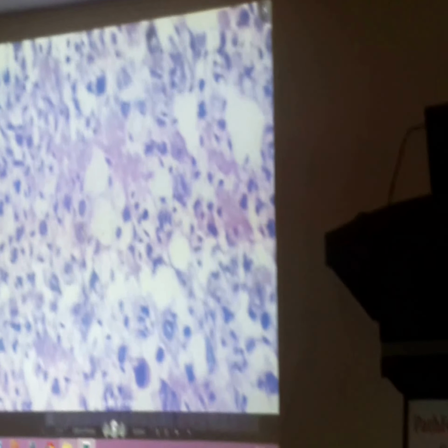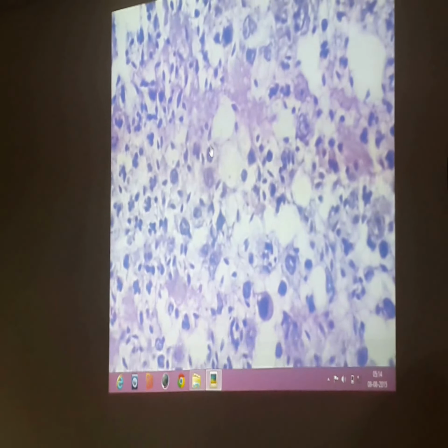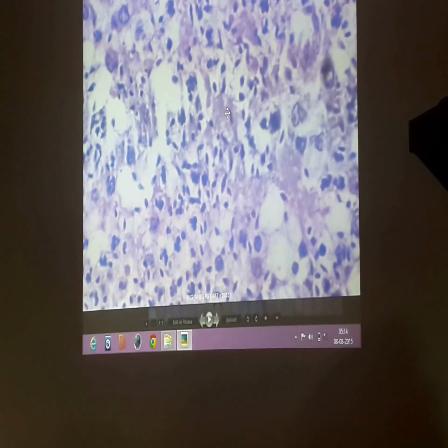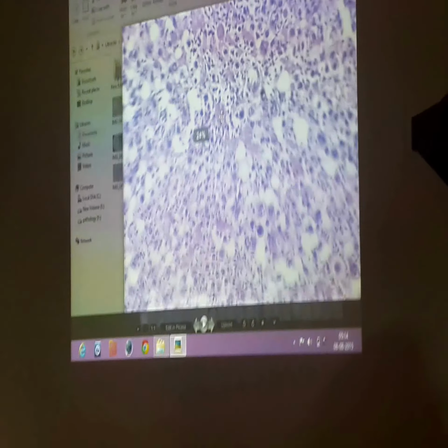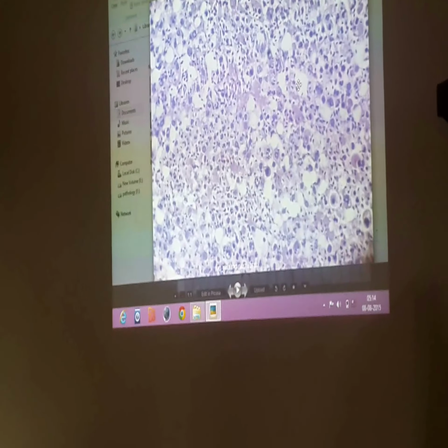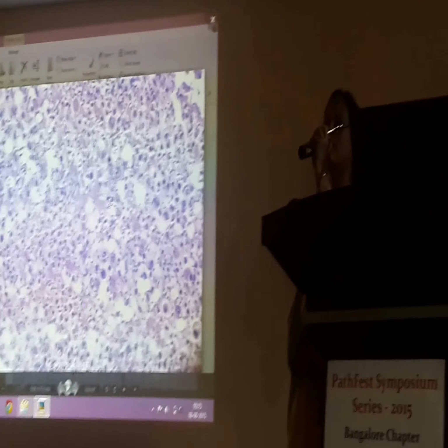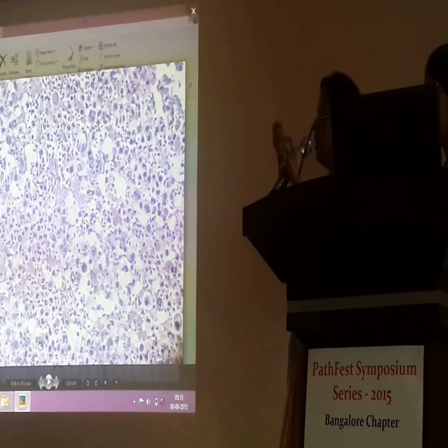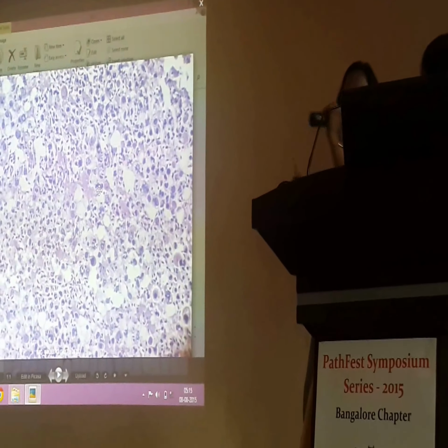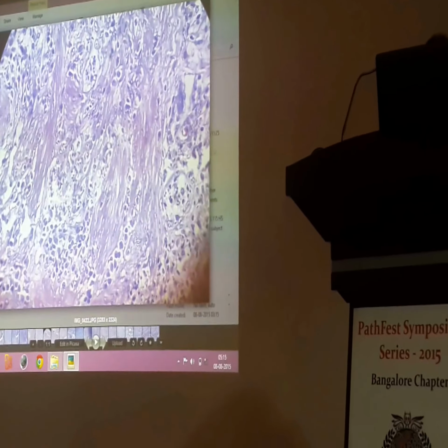It's like? Sperm, yeah. Yes, I just gave you this only to observe the sperm heads here. This is sperm granuloma. This is the lumen. So this is post vasectomy, where there is a nodule. Then leakage of the sperms gives rise to sperm granulomas. This is the lumen. I'll just show you one more section. Maybe we can move.